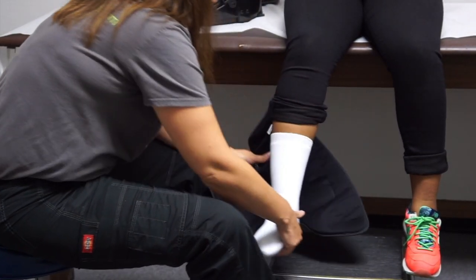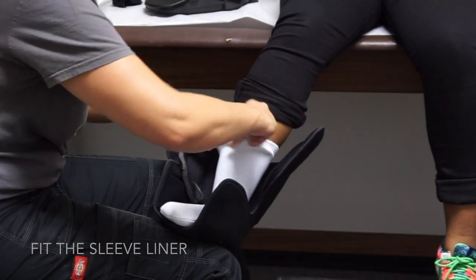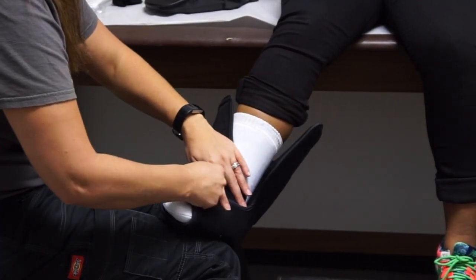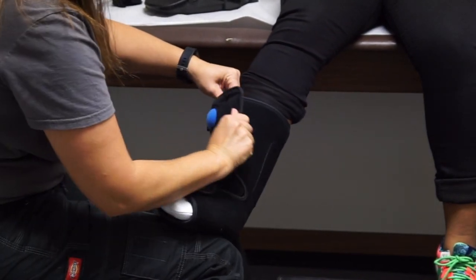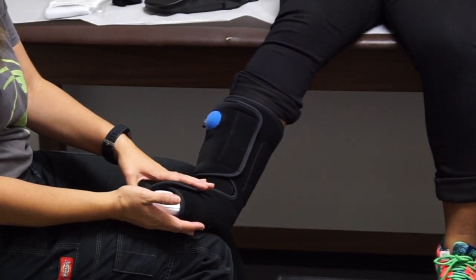We're going to have our patient slide in, and we want to keep in mind that the patient is going to be in a little bit of pain — they either have a sprain, strain, maybe they've come out of a cast, or this is in lieu of a cast to immobilize them. So they're not pain-free at this point and we want to be gentle, putting them in the boot — just the liner part first.